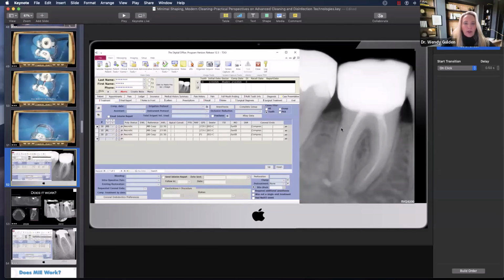This is 2 questions. One, in young patients with large vital pulps, do you still use these small files? The answer is yes, I still use these files, but I'm going to get a lot of the coronal pulp out first with files, and I might use something like that 1004 or 1006, that file that I used to create a little bit more funneling on that one case where I was having trouble getting the files in. I might use that, or you could use a barbed broach or a small Gates Glidden to get out the bulk of the coronal pulp.